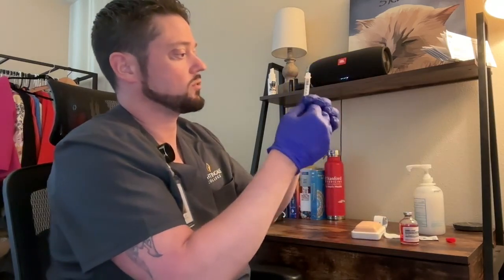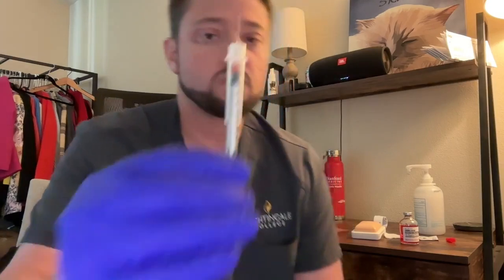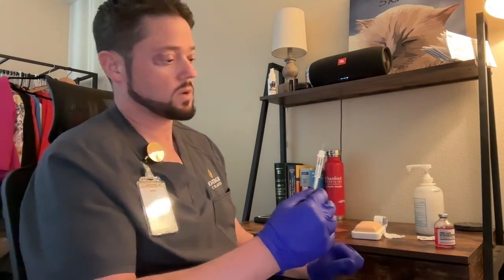We will then remove the needle from the bottle. We will check our syringe for air. We will flick that air to the top and reposition our plunger. Okay, so we have 0.1 ml of the tuberculin protein. We are then going to administer the intradermal injection.